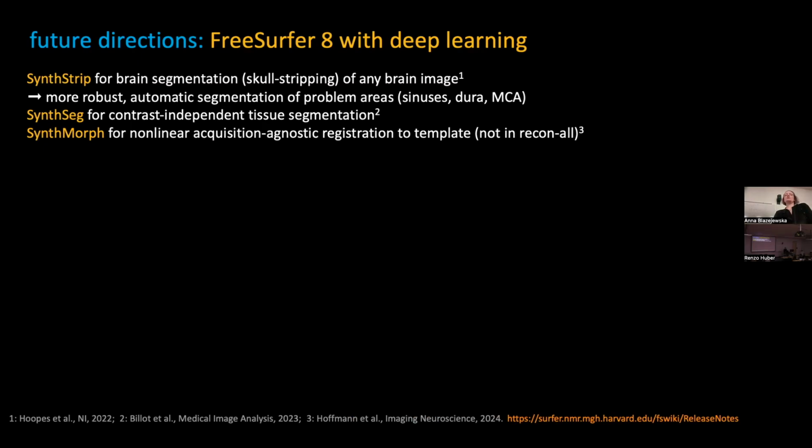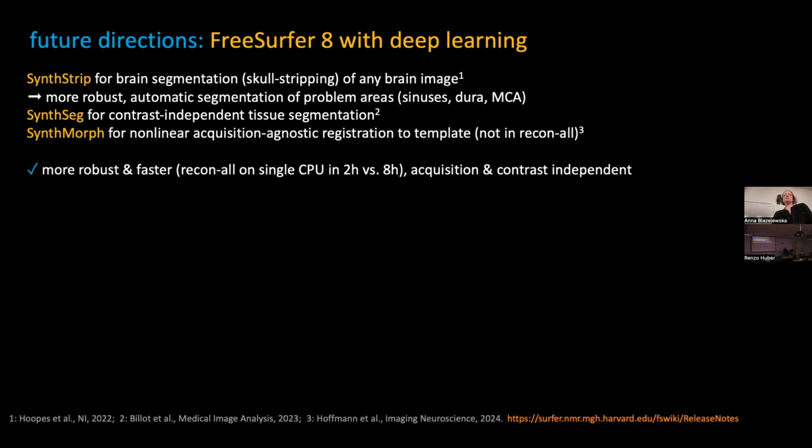I believe there are also segmentations that can somehow deal with the white matter lesions and also with extracerebral structures. I again haven't tried those, or with ex vivo smaller pieces. So anyway, there's a lot of development there. And these methods are supposed to be, as I said, more robust, but also significantly faster. And that I can confirm. The Recon-All with the new upgrades is much faster.